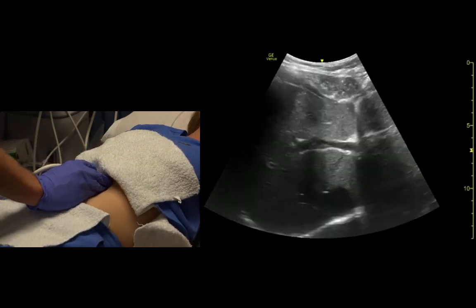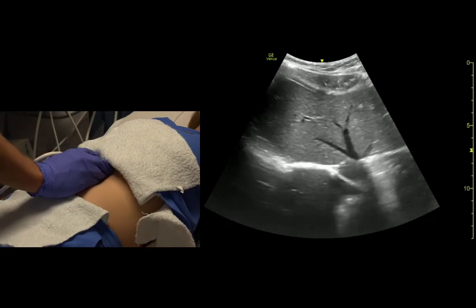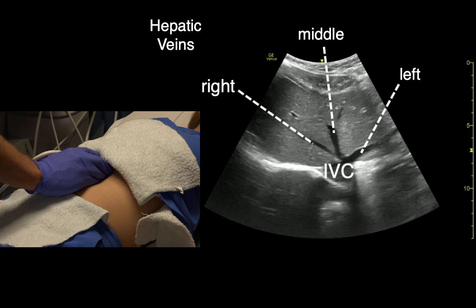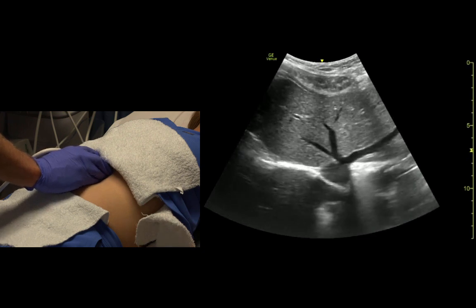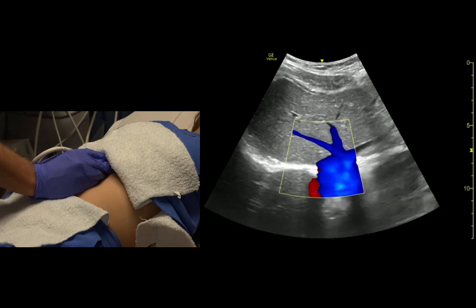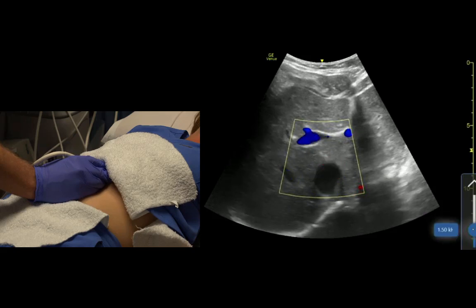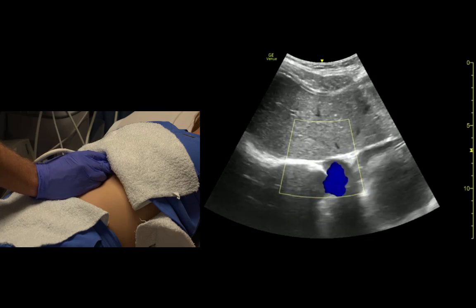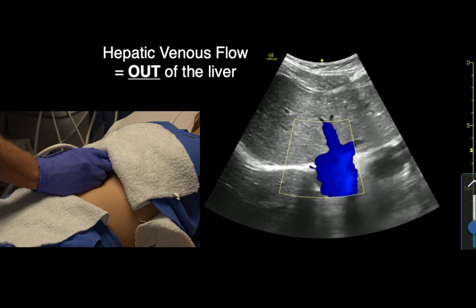If we fan way up — big breath again — we see the hepatic veins that drain down towards the IVC: right, middle, and left. And if we look at the hepatic veins, they should mostly light up blue because the blood flow is going away from our transducer into the IVC.